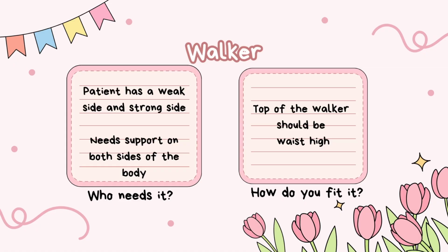Next, let's talk about walkers. Who needs a walker? Well, any patient who has a weak side and a strong side, but still needs support on both sides of the body. It's kind of a combination between the needs of crutches and canes.